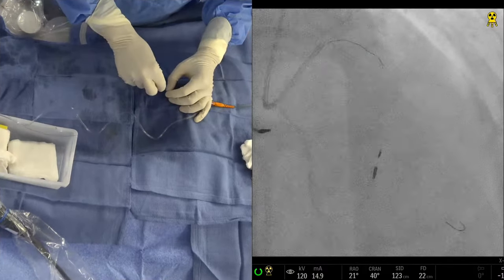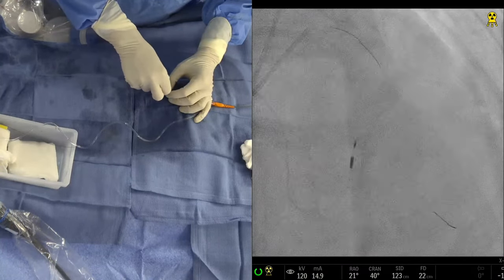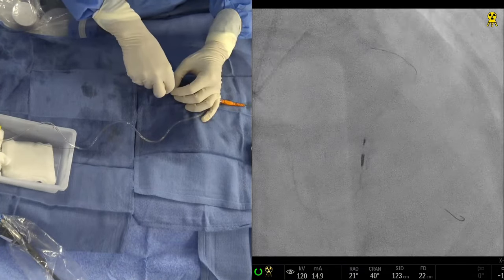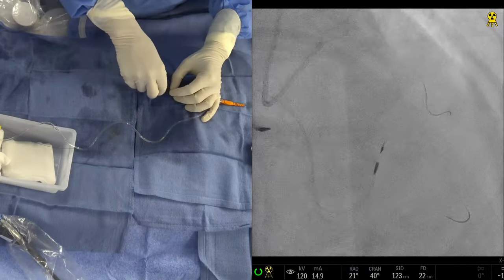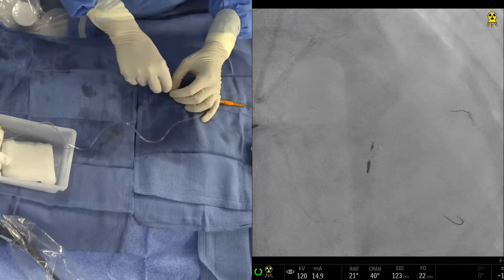Or it's completely normal and severe calcification. So even with the left main. So I say, and that's what the guidelines are, that the screening test should be CT angio. I'm a firm believer of that. In this particular case, after the thallium was negative, what made you go for a CTA? Because the patient continues to have angina.